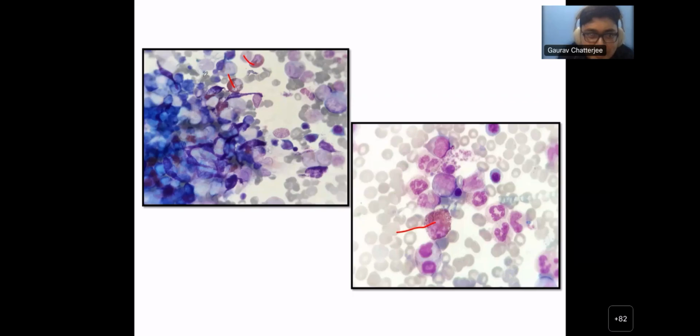Can you tell me what these cells are? This one, then this one. Can you differentiate them from eosinophils? You can, right? What do you think they are? Anyone else? Anyone want to comment on what these cells are? Very good. Why do you say they are mast cells?